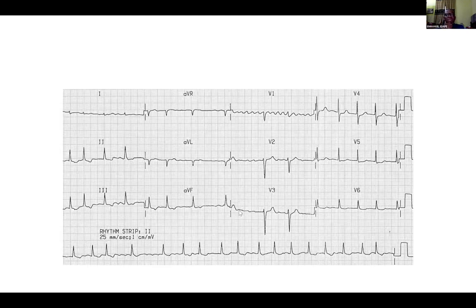So I got this ECG from Life in the Fast Lane. That is where I got it from. So the reading here is AF, and this patient is hemodynamically compromised. What do we do? We just have to cardiovert, apply your medication, and move on with it to see whether the patient can be helped.